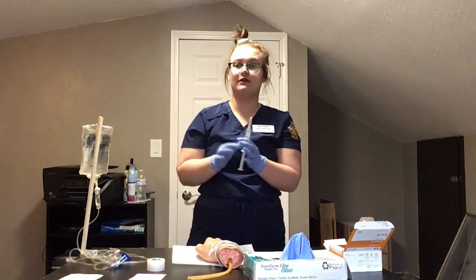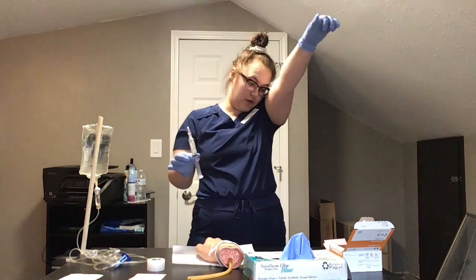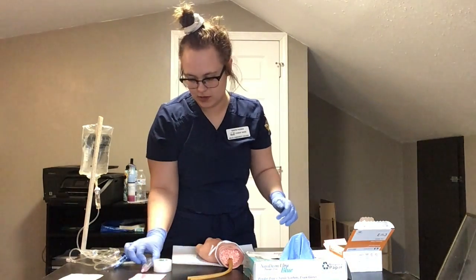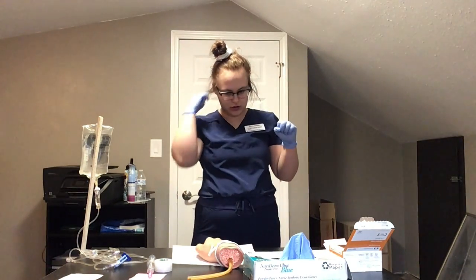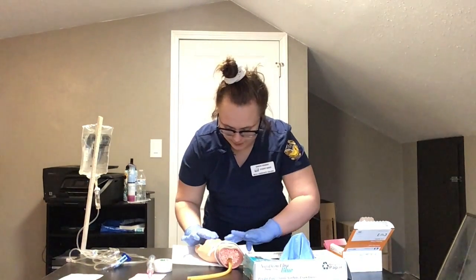And then I would place this on a clean area. So this is clean, so I'm going to place it right here. Now that this is ready, I'm going to check my vein again.